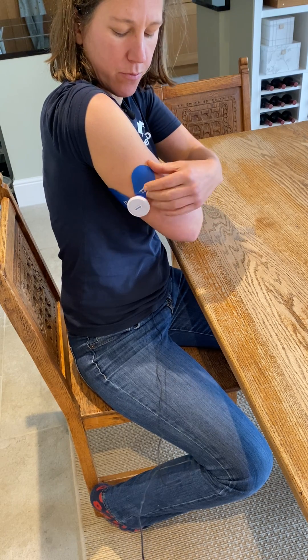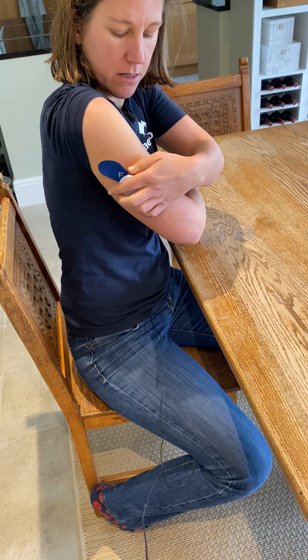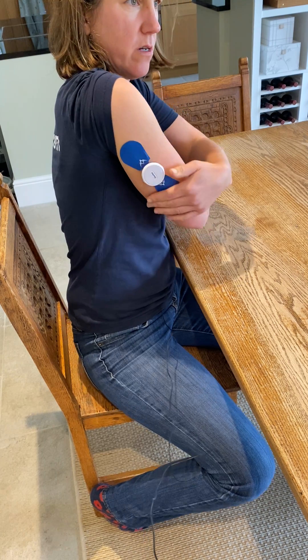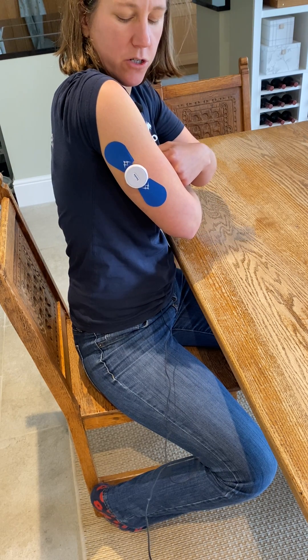On my arm I would probably be better off going for option number two, which is in a vertical line. I'm making sure that I'm going in the middle of the back of the upper limb for this. So that's for elbow extension.